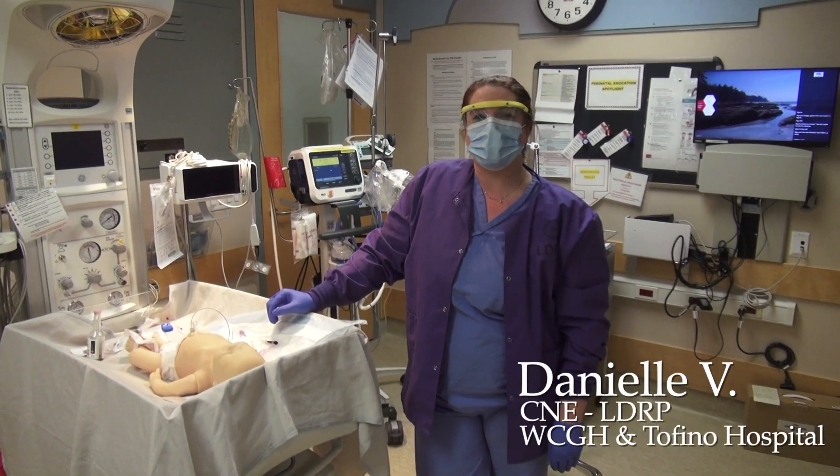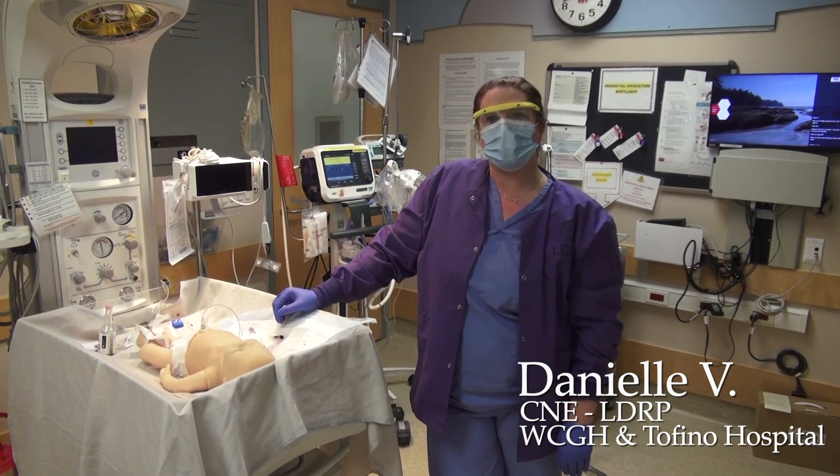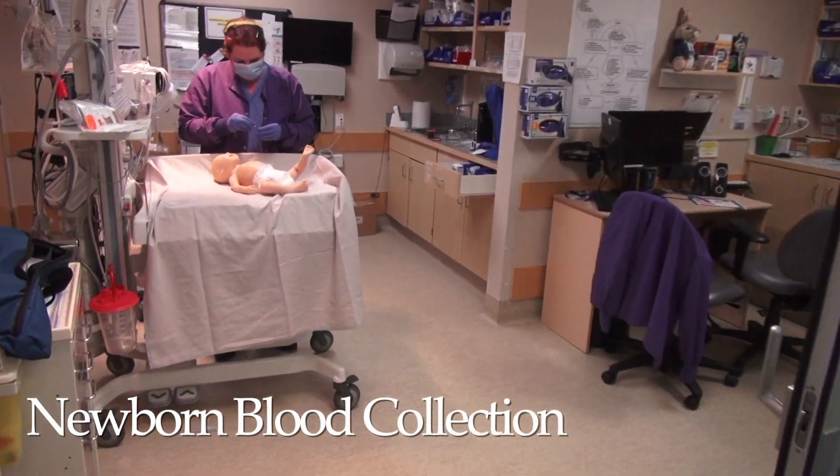Hi, I'm Danielle. I'm the CNE at West Coast General Hospital for the Perinatal Program. Today we're going to review newborn blood work collection and sampling.